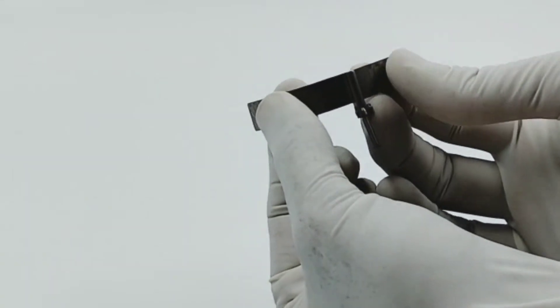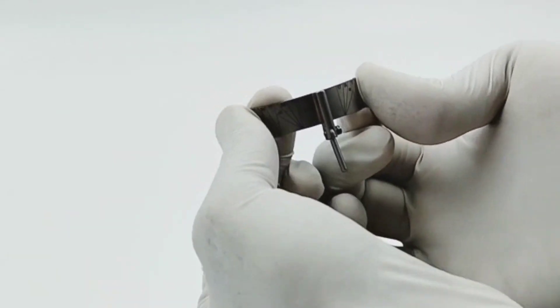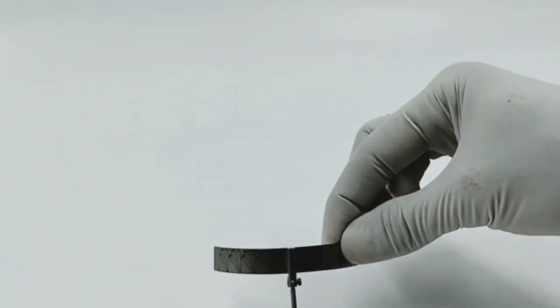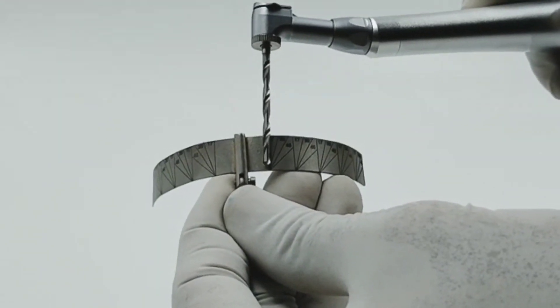The guide is placed into a 2mm osteotomy that is made in the midline position of the maxilla or mandible and the band is contoured to follow the arch of the opposing arch.